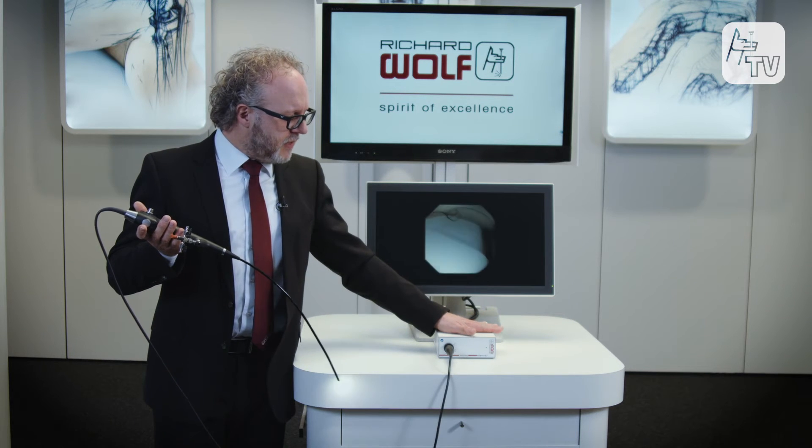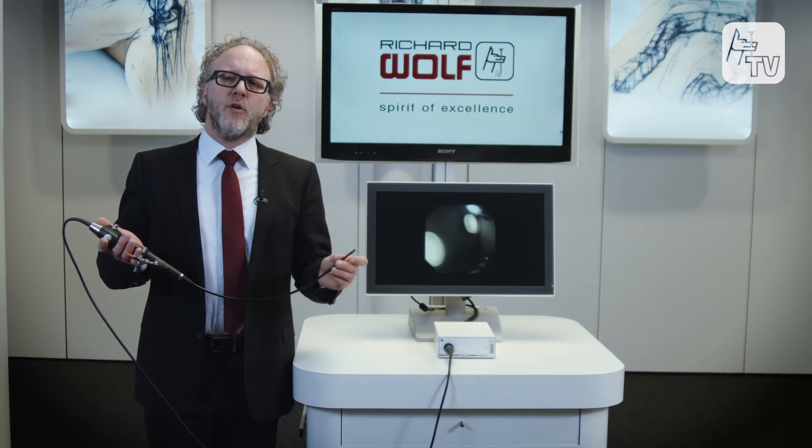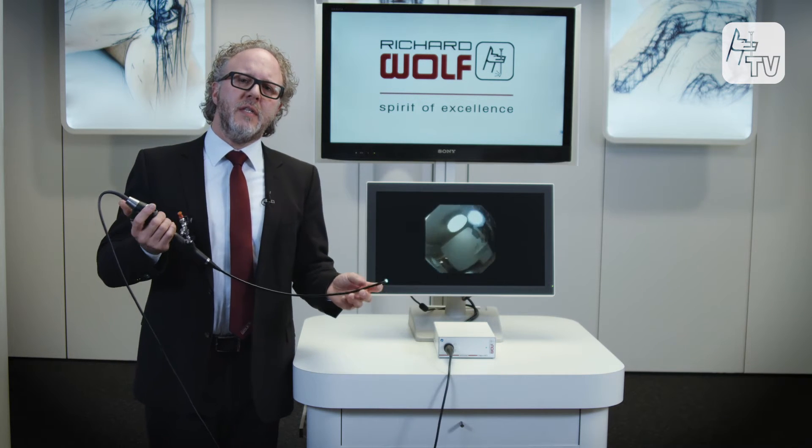This means that for this flexible cystoscopy you only have one box and an instrument, which allows you to carry out all diagnostic and therapeutic procedures.